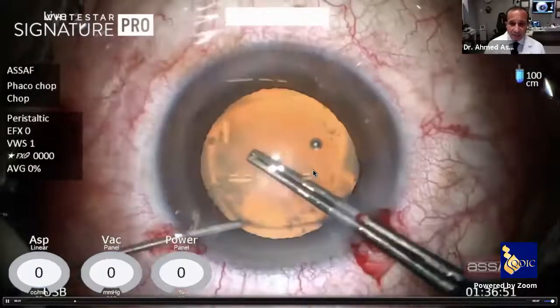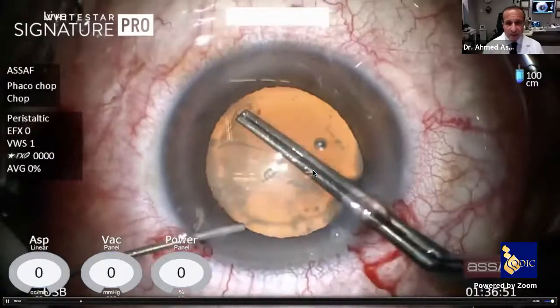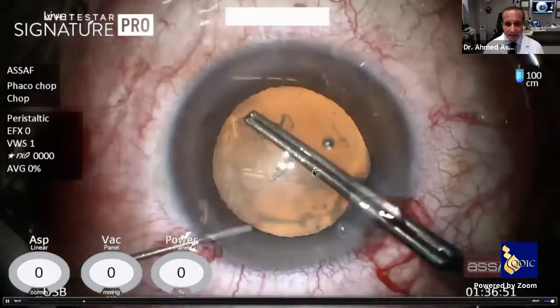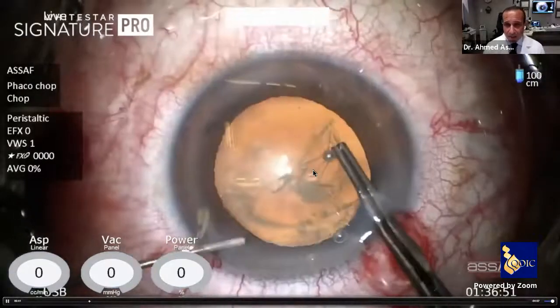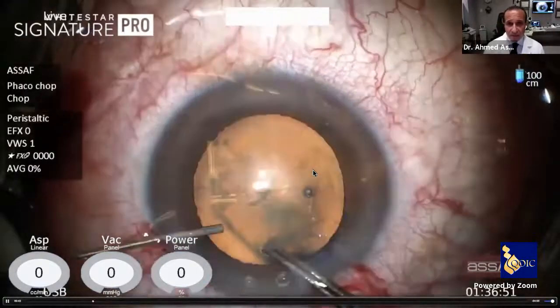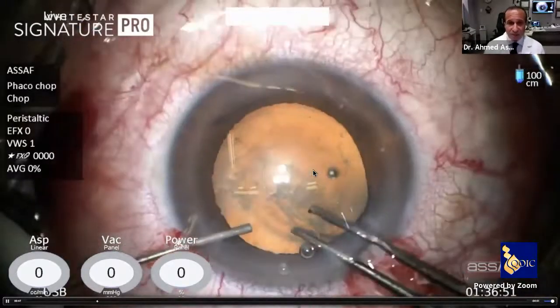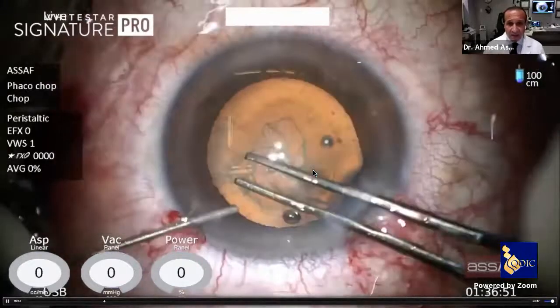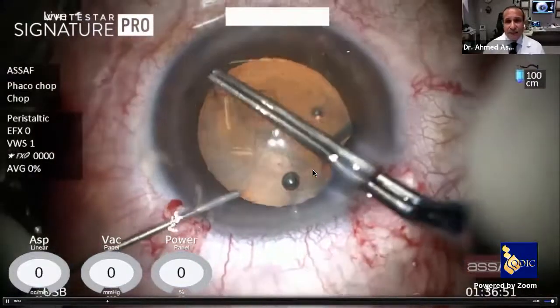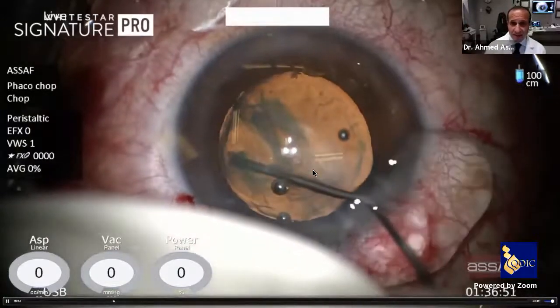Because of the high incidence of opening of the posterior capsule, just keep a three-piece IOL as a backup lens. Here, while executing the rexis, I try to make it as large as possible and still allow for three-piece IOL implantation in the sulcus, just in case we have an open posterior capsule, and do optic capture. So I'm trying here to keep my rexis between 5 to 5.5 millimeter in diameter. This is the sweet spot where we can do safe phacoemulsification and do optic capture just in case.